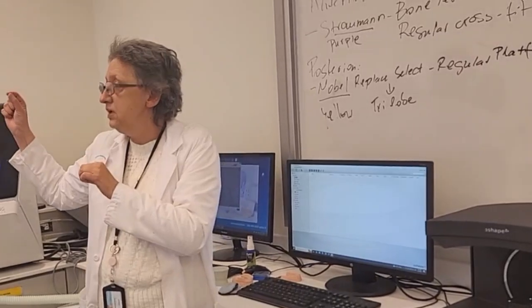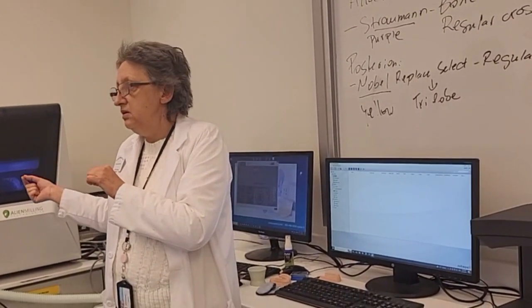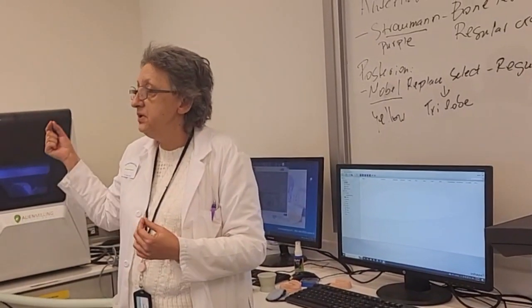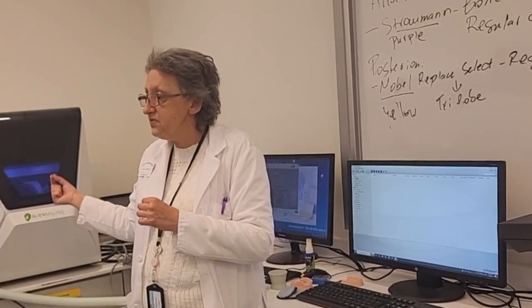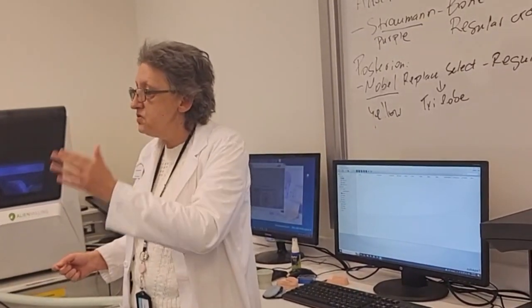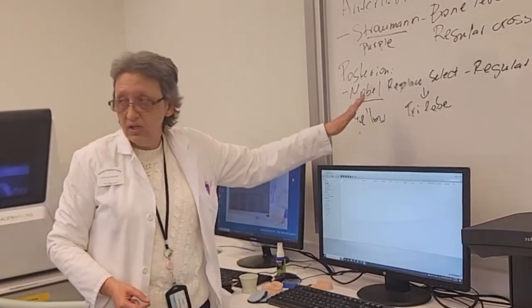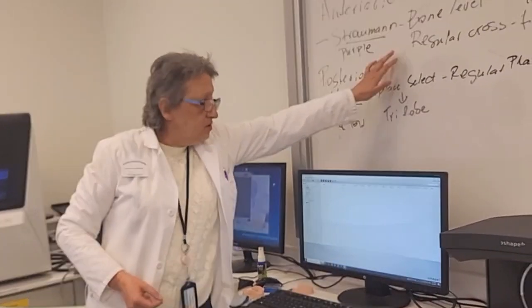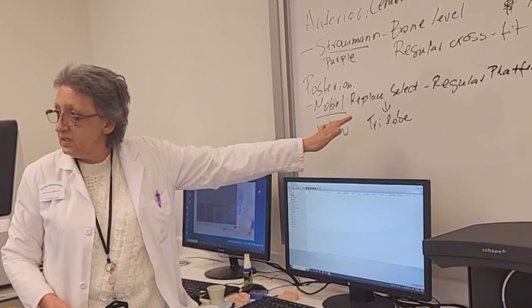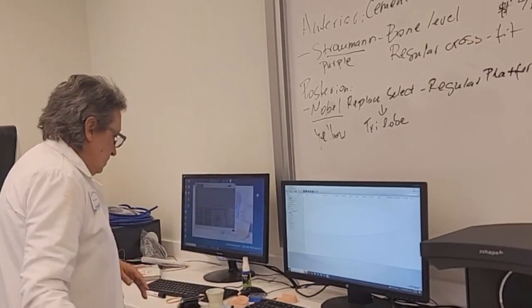You're not gonna put a transfer coping that is maybe green with a yellow. The green may be narrow, so it's for a narrow implant. So it's color coordinated, so it's easy for you to identify the parts that you need. Each company has their own color. So even though we are using standard or regular implants from both companies, each of them has their own color.